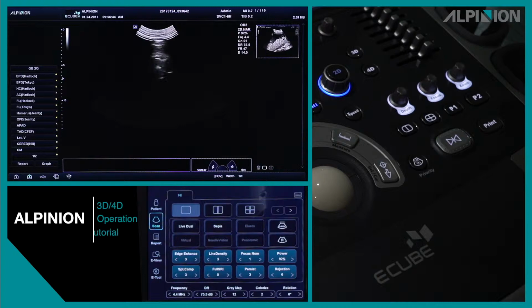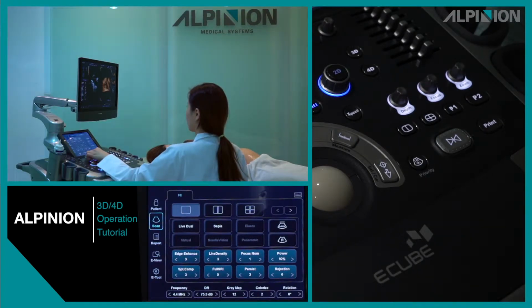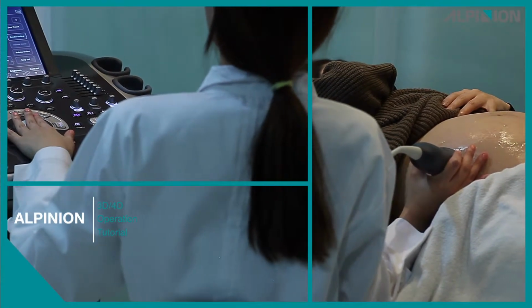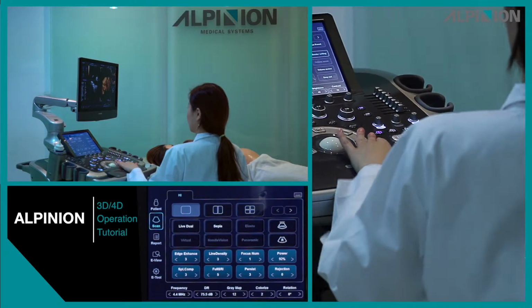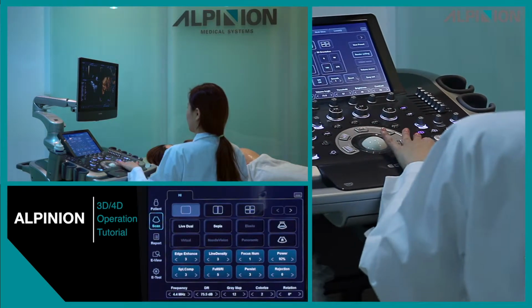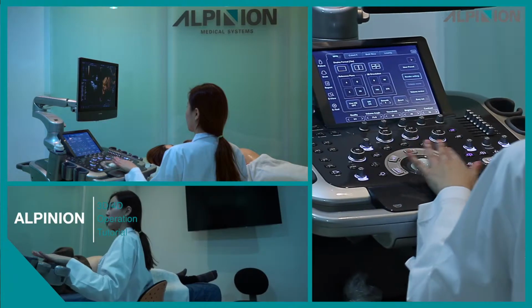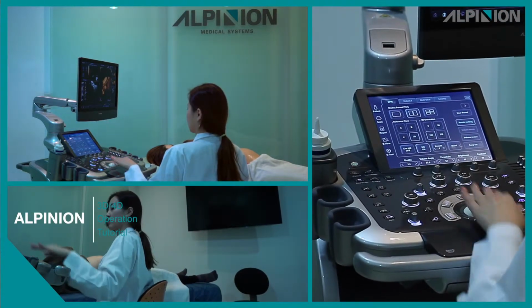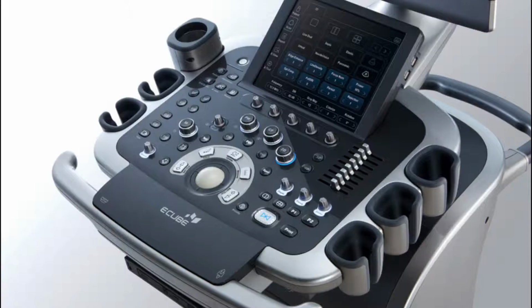Alpinion 3D 4D Operation Tutorial. This tutorial video is for helping our Alpinion users to operate our 3D 4D mode more easily and properly with our eCube11. If you get used to operating the 3D 4D mode, you will be able to take many advantages of 3D 4D as a useful clinical tool.